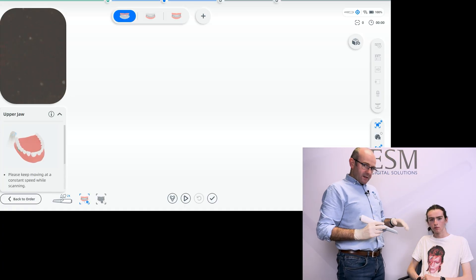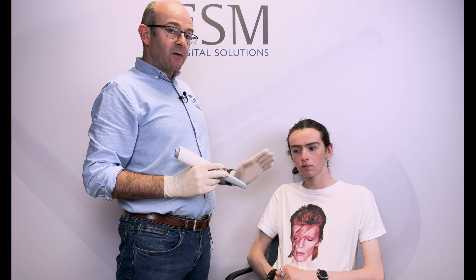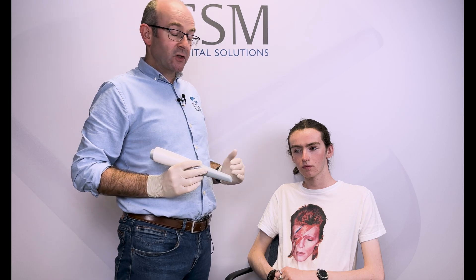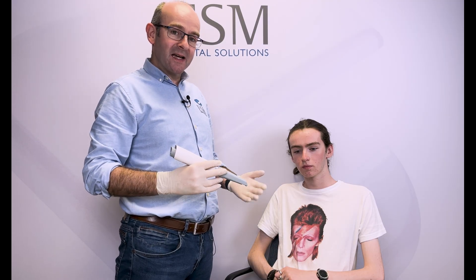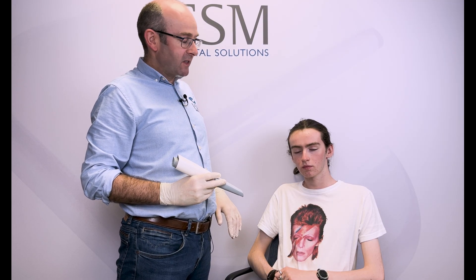Before we start scanning, I just want to talk about some of the ergonomic aspects. I'm obviously scanning Tom — he's in a seated position. This works really well from a patient's point of view because they're in a dental chair, cortisol levels increase and so on, so it's a very comfortable experience. Patients often say when a scan happens they're expecting a lot more to happen, so it can be a really good patient experience.